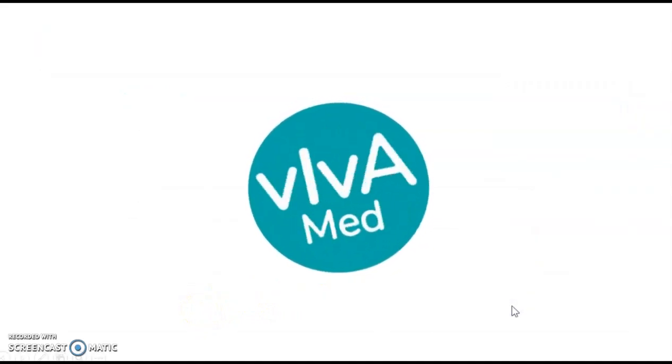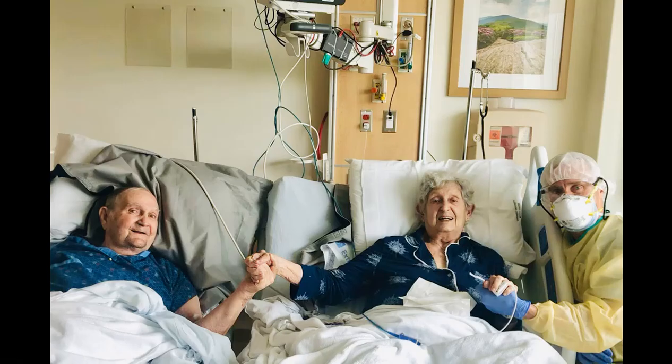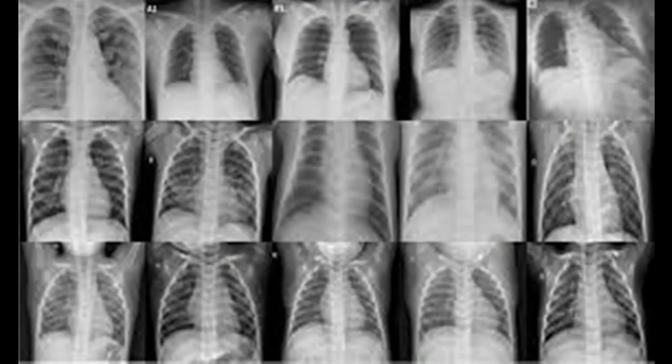In essence, this is the vIvA-Med project with which we hope to contribute and support health personnel in the early care of patients with respiratory diseases in the context of COVID-19, as well as a record and storage of information and diagnostic images for subsequent studies and scientific advances.